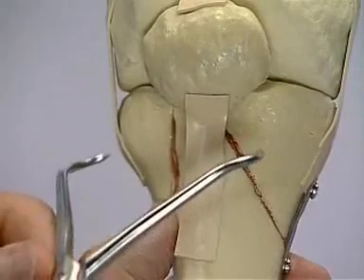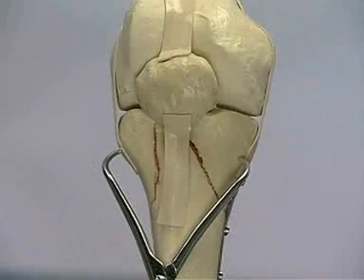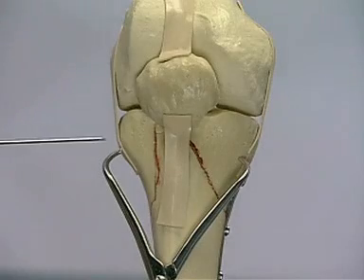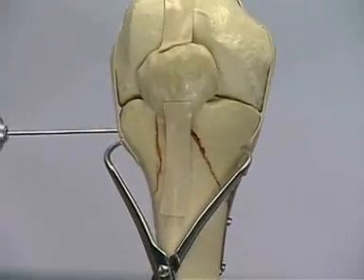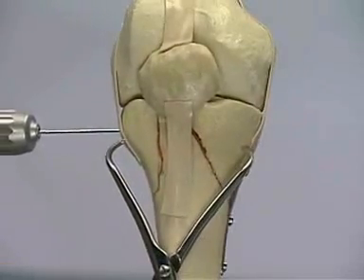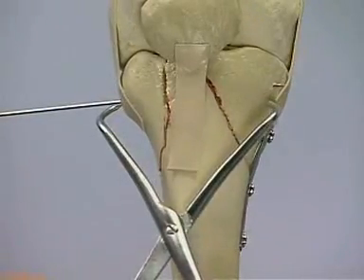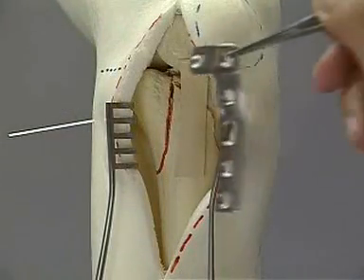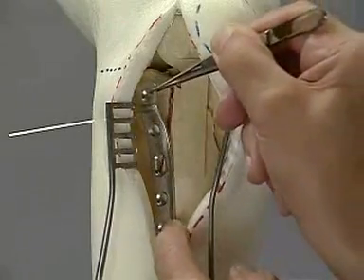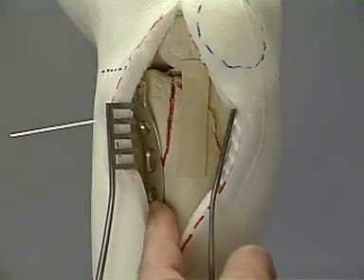After reducing the lateral construct, it is best held in place by a pointed reduction forceps. One or two Kirschner wires placed parallel to the joint line further secure the reconstructed articular surface. After removing the reduction forceps, an L-buttress plate is placed to support the lateral condyle. Alternatively, depending on the fracture configuration, a T-buttress or a tibia head buttress plate can be used.